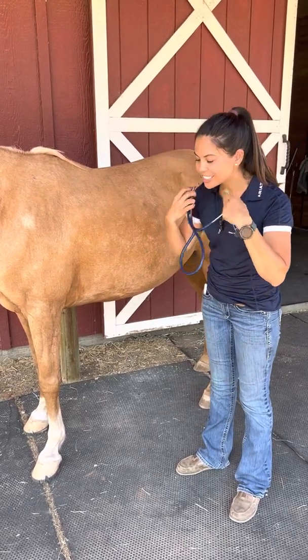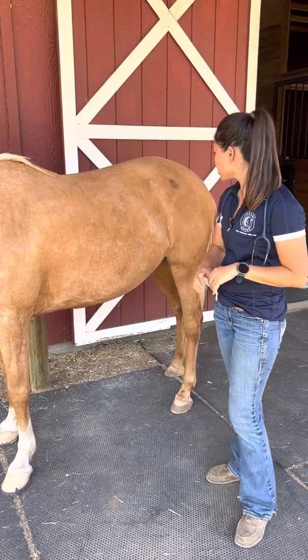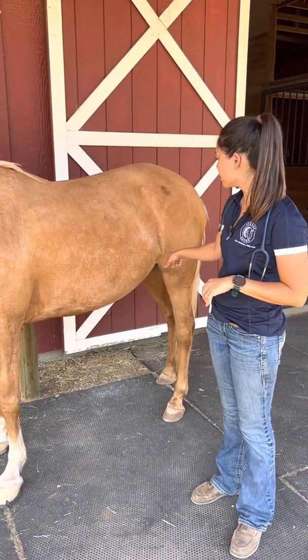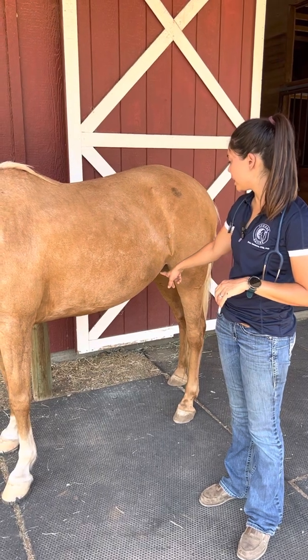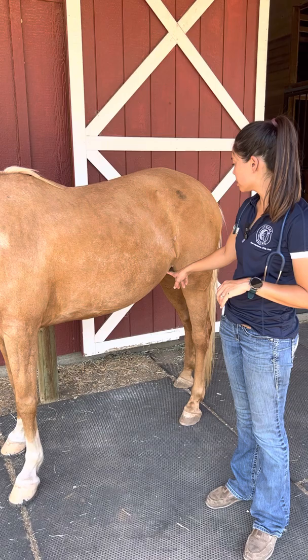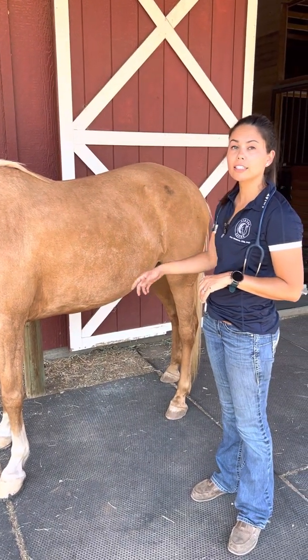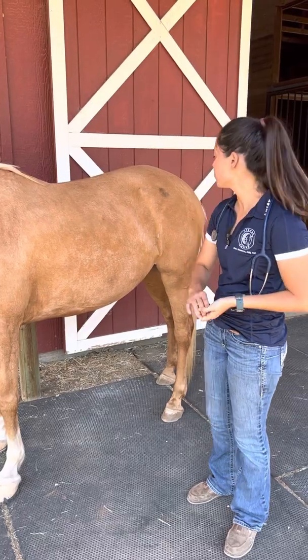All right, so we did heart rate, and we did gastrointestinal sounds. To look at respiratory rate, I like to focus right here on their flank, and you can see her breathing in and out. So that's 1 breath, 2 breaths, 3 breaths. You're going to do that for 15 seconds, and then multiply that by 4 as well.